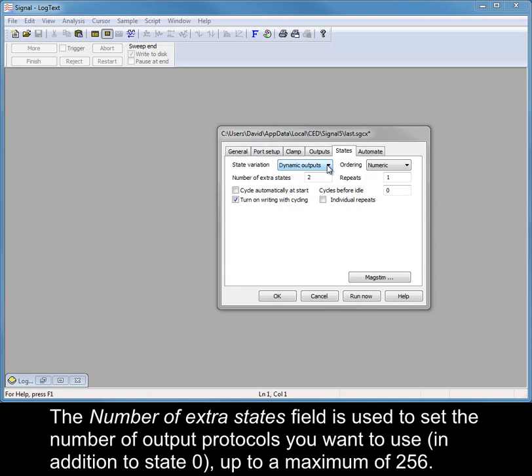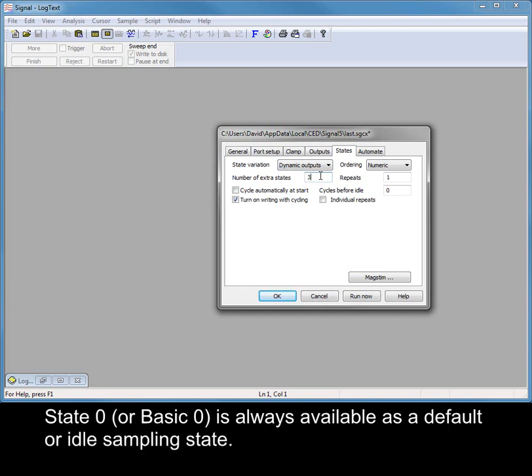The number of extra states field is used to set the number of output protocols you want to use, in addition to state 0, up to a maximum of 256. State 0, or basic 0, is always available as a default or idle sampling state.